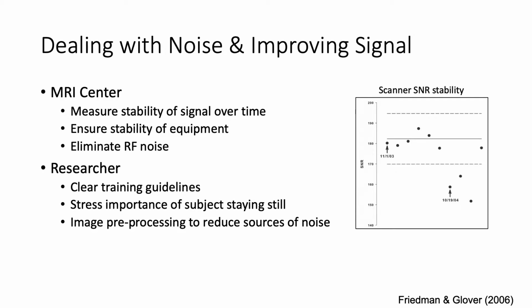But as experimenters, we also have our own things we need to pay attention to. When we're training, we need to make sure everybody who works with the participant in a scanner is well trained, attends all the safety courses, has the correct supervision, and really knows what they're doing in the scanner and how to deal with subjects in the scanner, particularly forcing, or not forcing, I guess you can't really force somebody to stay still, but sometimes you want to.